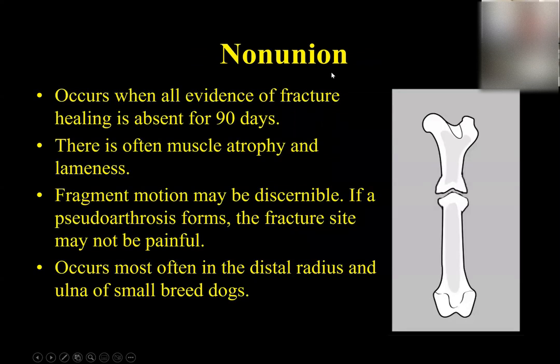Okay. A non-union. This is an example of a hypertrophic non-union. People will describe this as having an elephant foot appearance, because here's the fracture gap. The fracture gap will never fill in. There's not going to be ever any callus formation, but the adjacent fracture fragments are widened and expanded, kind of like an elephant's foot looks like that. Okay, so that is a hypertrophic.